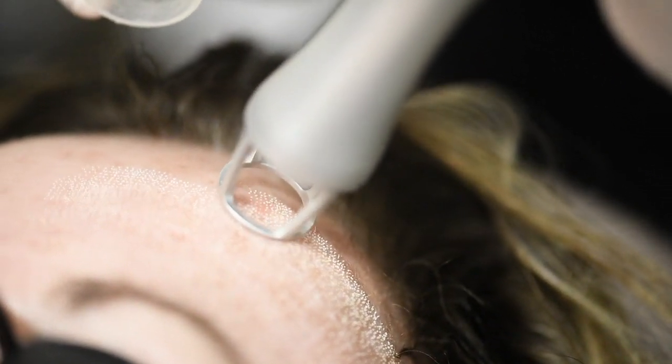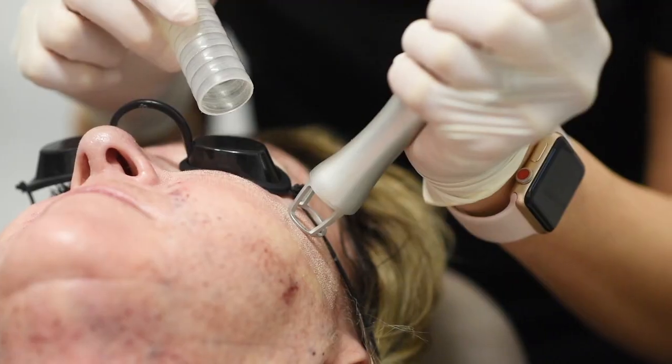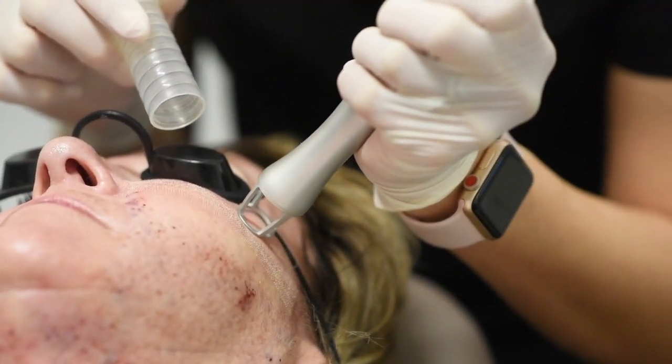There are different depth settings — some lasers go in deep, and some go deep and medium. We can pick different settings depending on your issues. If you have really aggressive smile lines or smokers' lines in the lower face, we may use a mode called fusion mode, which is a little more aggressive and requires more downtime. But typically on the average person, we do full deep mode on the full face. You walk out with these little grid marks, looking a little swollen, a little white, and a little red.